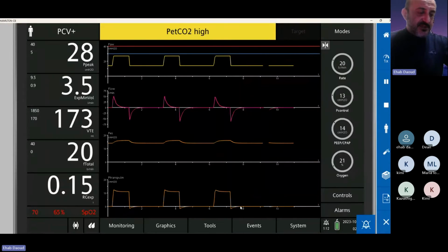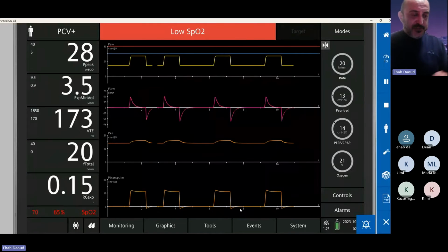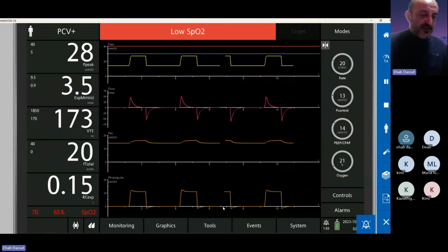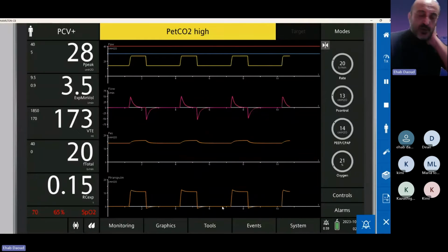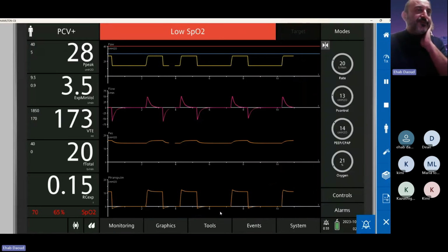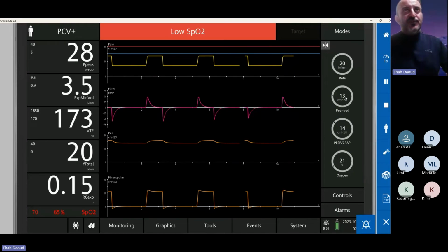So with this, we talked about a little bit of the PEEP, a little of the recruitment maneuvers, and a little of the benefits of the esophageal balloon. I want to go quickly over mechanical power. And if you remember, let's calculate the patient's mechanical power here.